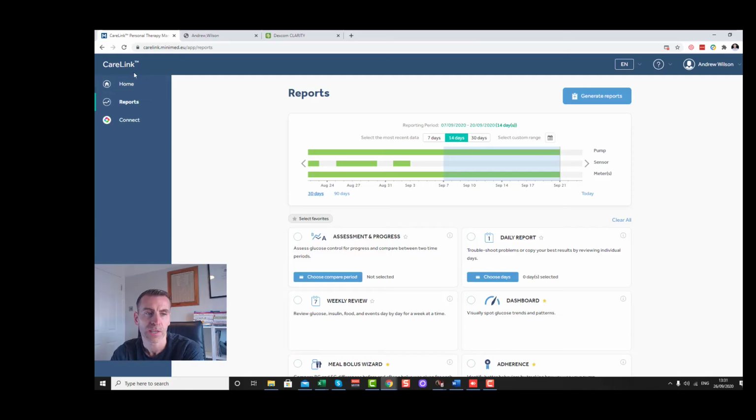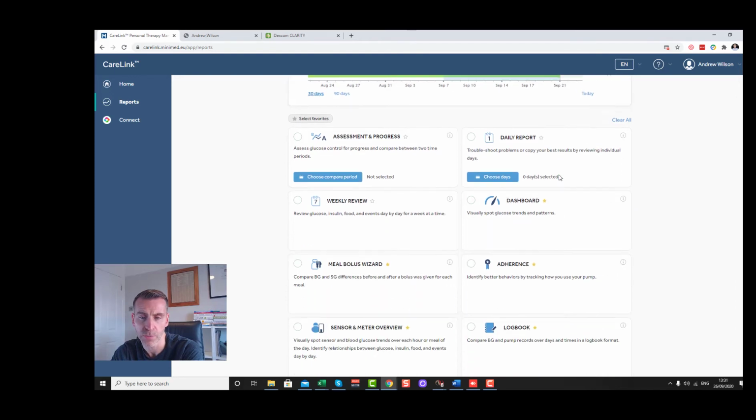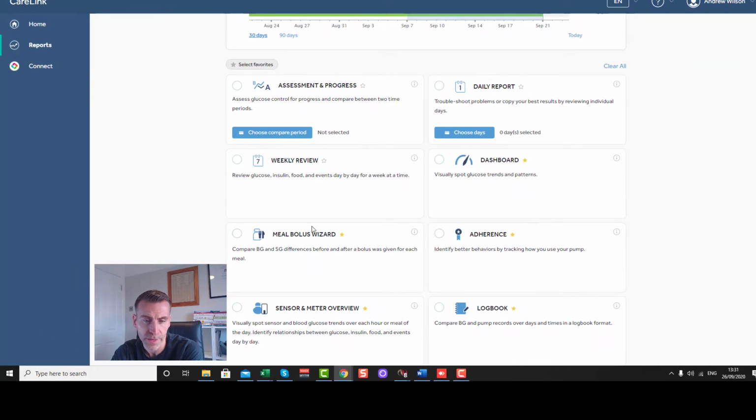The reports that both Medtronic and Dexcom provide are really useful. With Medtronic, I have a CareLink account, and I can log on my computer and I can see my graphs. They give you lots of different reports. This is the Medtronic CareLink app, desktop app actually, and you can look at 7, 14, 30 days or any selection of days you want, and you can run all of these reports. Okay, there is lots of information that it will give you.